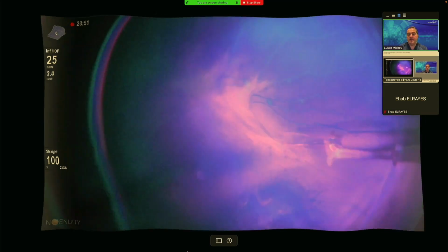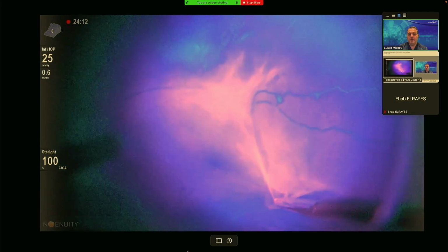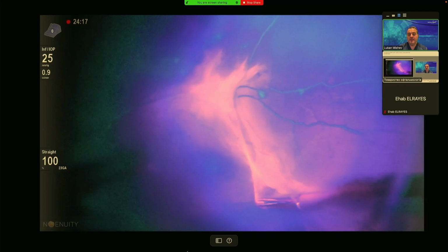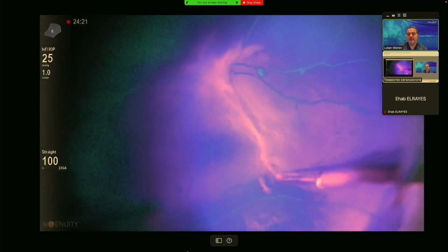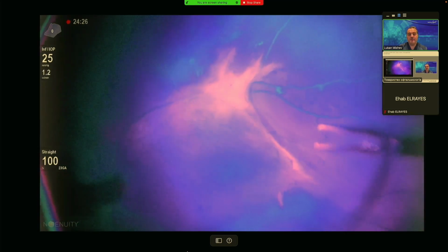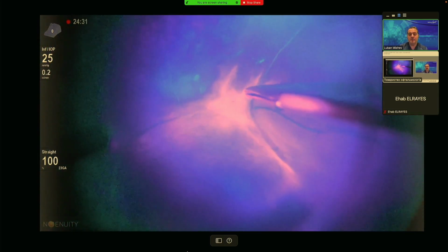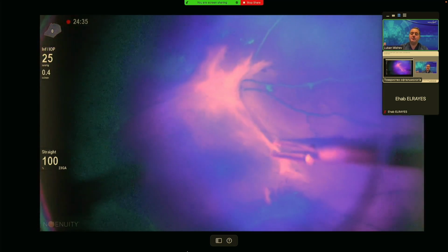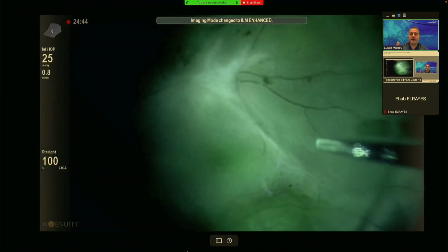So we need to modify our way of looking into the ocular structures, because the analog view sometimes contains a lot more info inside, but it's not highlighted. With the digital filtering, we can suppress certain wavelengths and we can enhance others which might be useful for us during that part of the procedure. So in that case, you can see another type of filter.